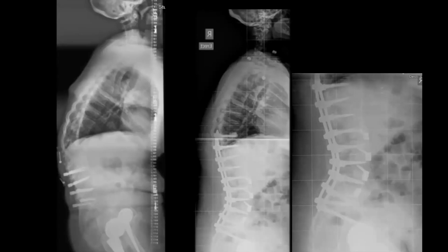And in this case, I used the HAP composite cage. You notice here a subtlety I'll point out is that I didn't actually put the screws on both sides. The cage itself has the ability to gain fixation to both end plates. What I tend to do when I'm going to do a posterior column osteotomy is put 2 screws into one end plate. So there's 2 screws into the sacrum here, 2 screws into, in this case, L3, 2 screws into L2, 2 screws into L1. You notice how I didn't lock my alignment of the end plates together here.